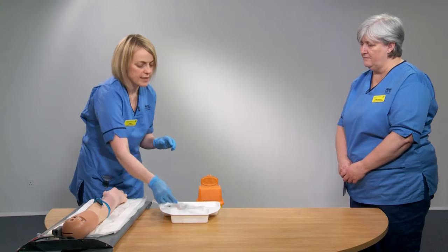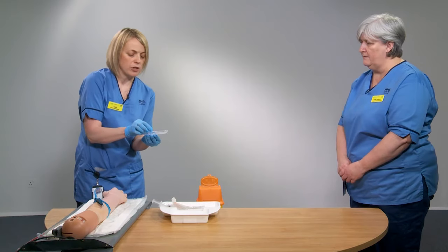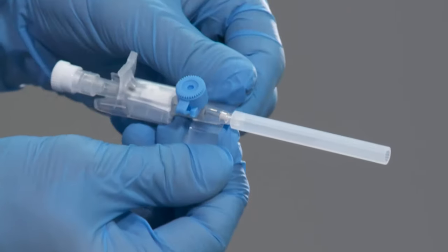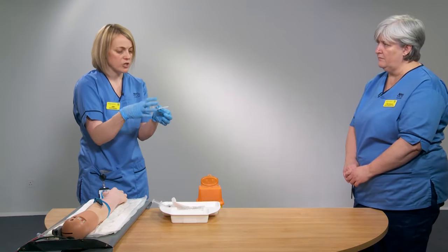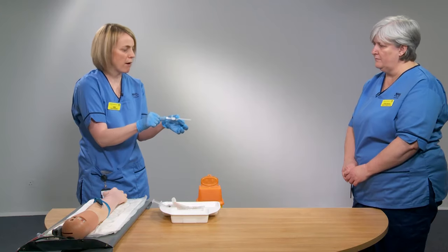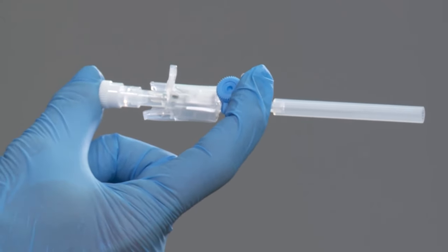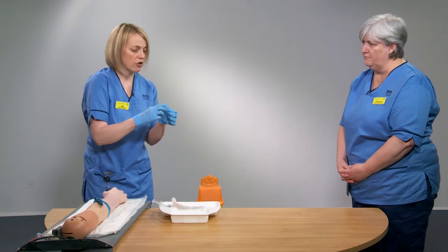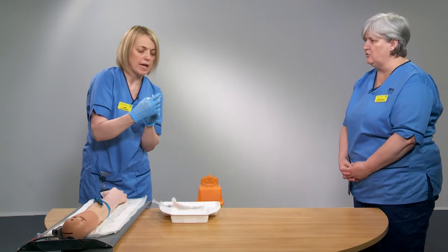Once that is dry, we're ready to start the cannulation process. Tip your cannula out into your hand and first flatten the wings. The easiest way to hold your cannula, to ensure all sections are initially held together, is to hold it in a C-shape — thumb at the white bung at the end and index finger over the blue hub. Then unsheathe your needle. If you're holding it correctly, you should see the open beveled edge pointing to the ceiling.